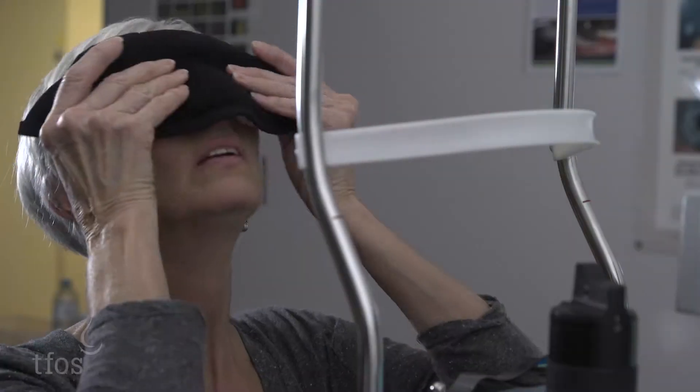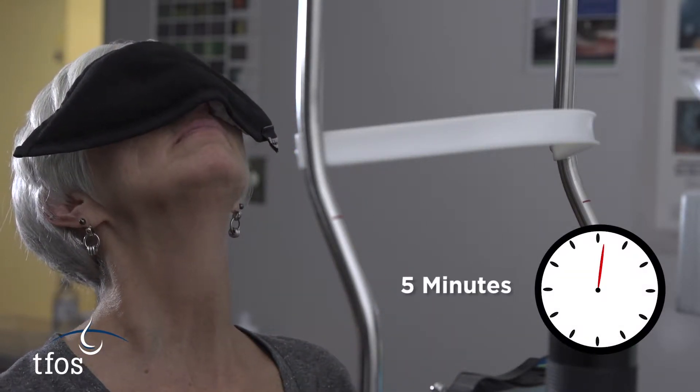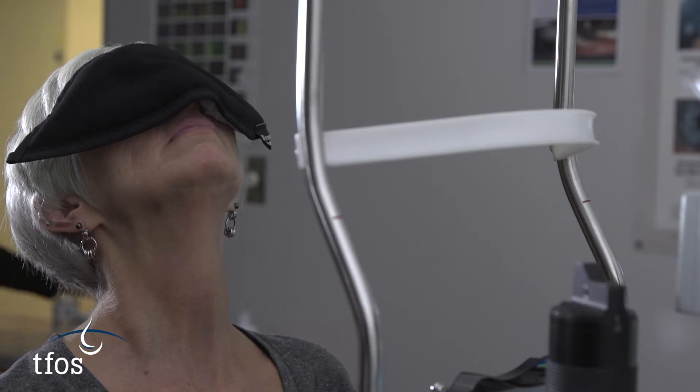To facilitate expression, the glands are first of all warmed to melt the oils. Practitioners can choose from a wide range of devices that are available to heat the glands. A gland temperature of 40 degrees Celsius is desirable.